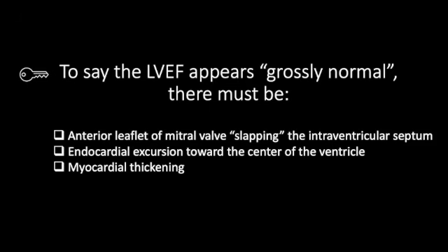And then those walls, or the myocardium, should also thicken during systole and show us that there's good contractility that's actually reducing the volume of the left ventricle, which is the surrogate way of knowing that there's actually movement of fluid out of the ventricle, or being ejected from the ventricle, during systole. Let's look at these in real time.